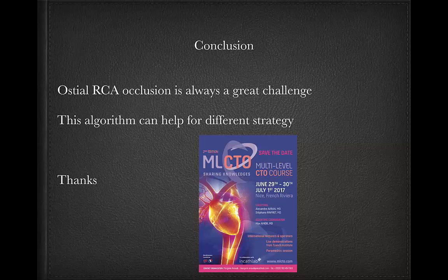Thank you, Alexander. This was a phenomenal presentation. As you said, this is something that's very common. It can be very stressful for people, and obviously requires experience in all techniques: retrograde, antegrade dissection, reentry. So it's for advanced operators doing these very complex cases. But I really like your algorithm. I think it breaks it down to different discrete steps and makes it easier for people to follow a pathway and have plan B if plan A doesn't work. So I think it's a wonderful algorithm. It would be great to have it published, so we're excited to see the publication coming out for the algorithm.